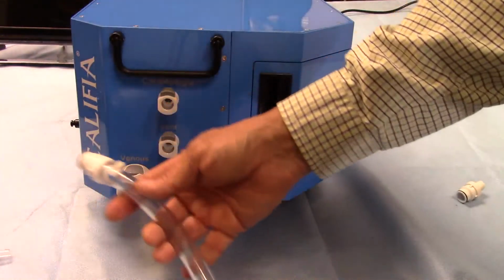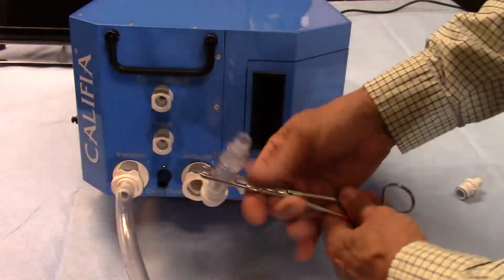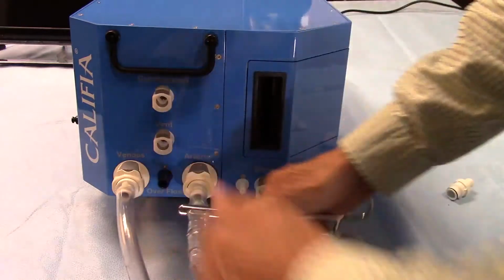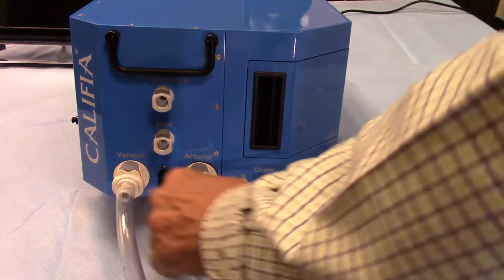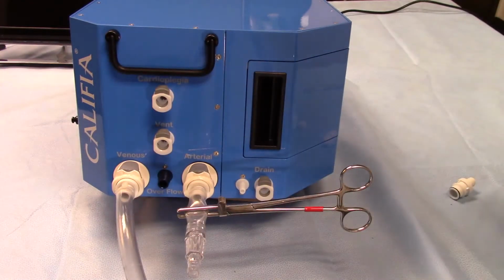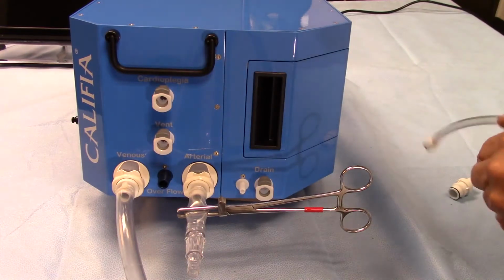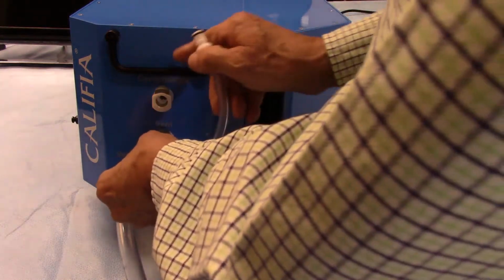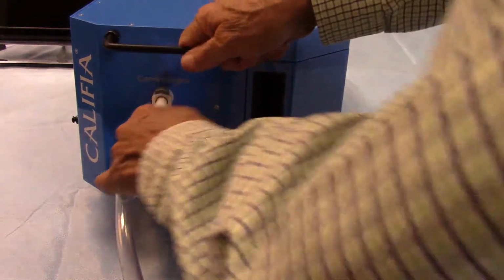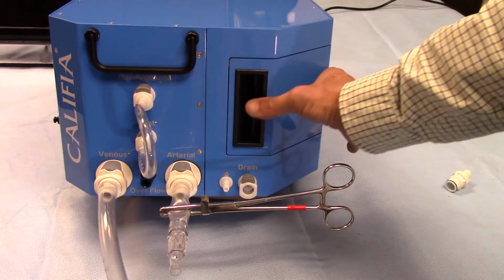We talked about making these quick disconnects. We're going to go ahead and put those in right now. We've got the venous and the arterial. For priming, we're going to go ahead and put clamps on those so that we can prevent those from leaking. Since these, again, do not have a valve, what we do in basic ECMO application is to just make a little pigtail.